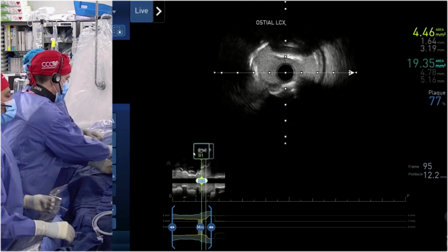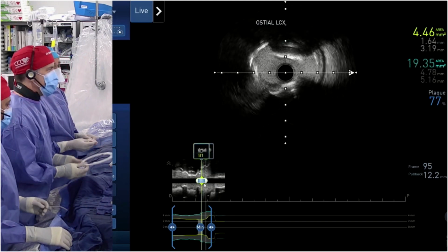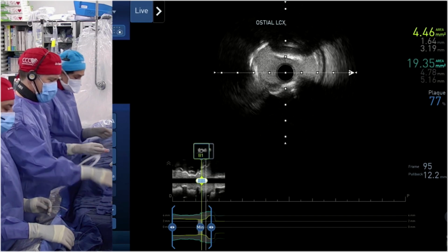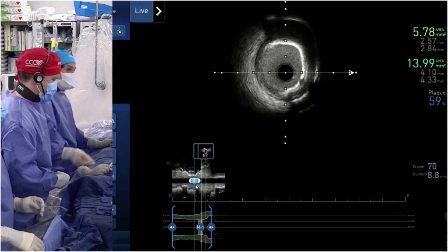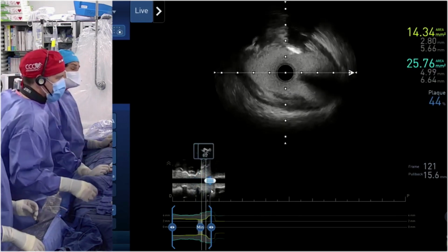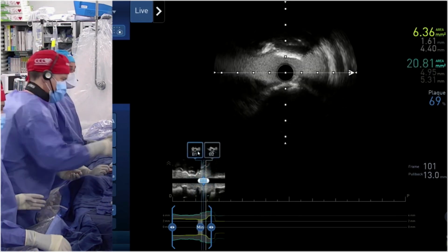Yes, too. Good point, Dr. Moreno. It's like a, see that 4.4. 4.46. You understand? Yes. But you see, Pedro, if you think we stent across and then you have a nodule, and then if there is a plaque shift in this patient, then we have to make a decision now.